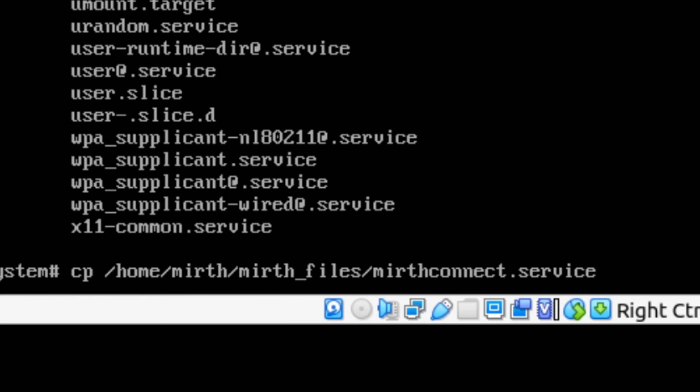So this is going to be copying from the MIRTH user directory this MIRTH Connect dot service file and we want to do space period. That's going to tell it that we want to take that file and move it into the current directory that we're in. That's what the period stands for. So we can press enter.